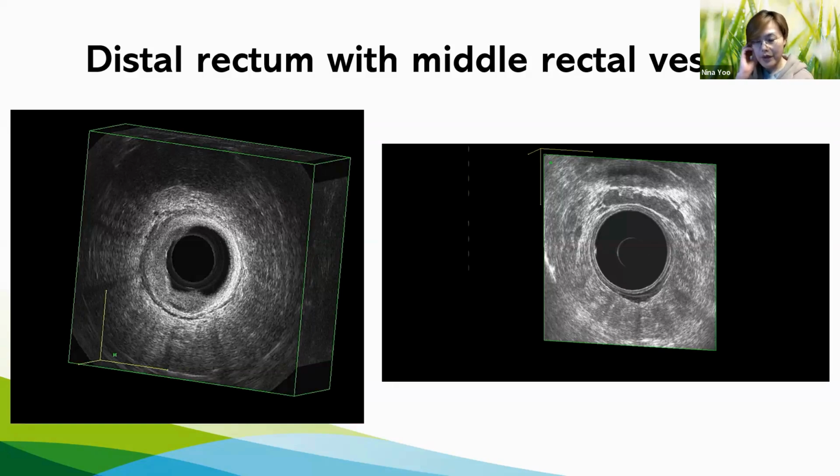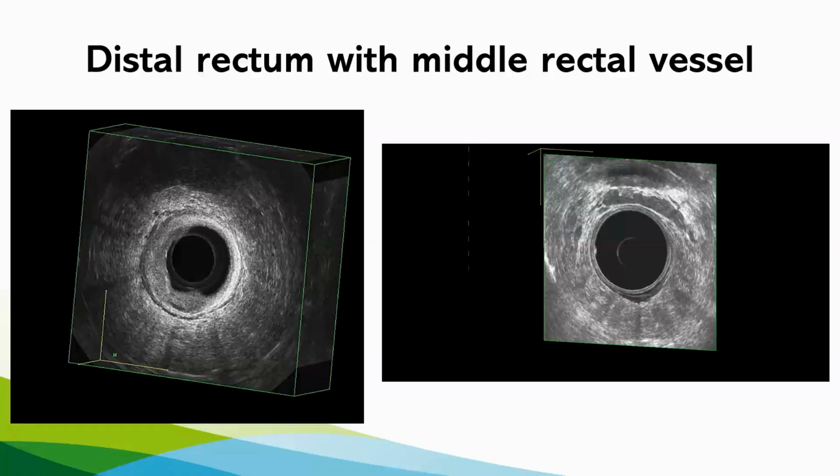I don't know if I gave you the answer for what you asked. Yes, you did. I was eager to know, in comparison to the 2D endorectal ultrasound, whether the availability of 3D in your system has displaced the role of MRI. And in the course of it, you've clearly shared that they are complementary. So thanks, it gives a lot of clarity.